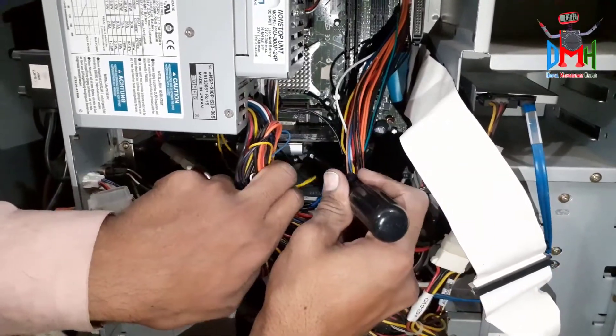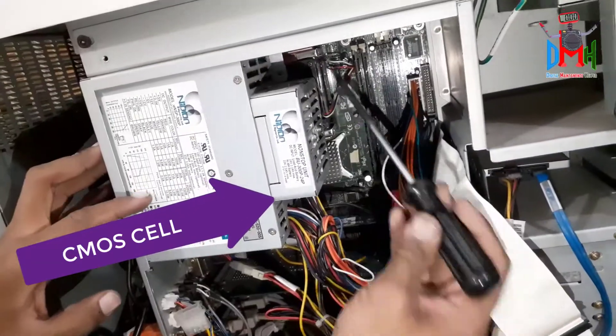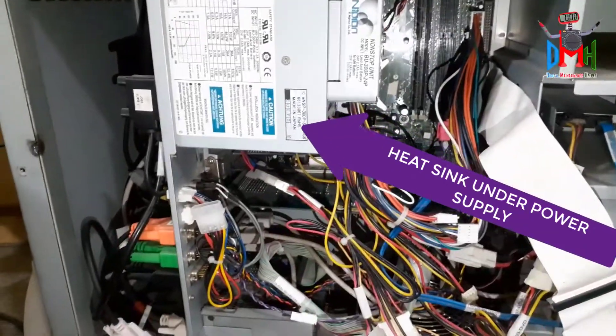Here is the graphics card, and beside the graphics card there is a CMOS cell. If your machine has a heating problem, you can change its thermal paste under the heatsink.